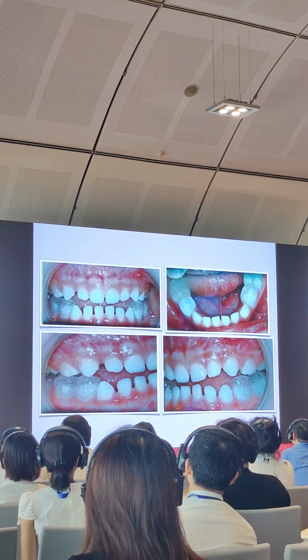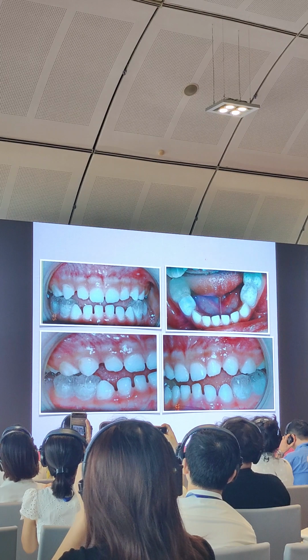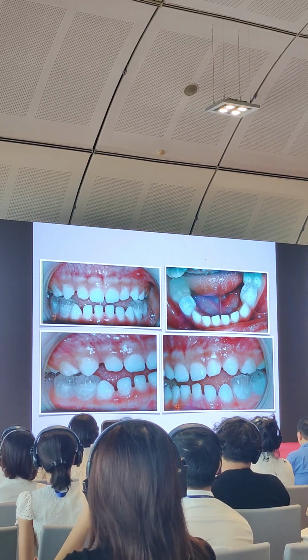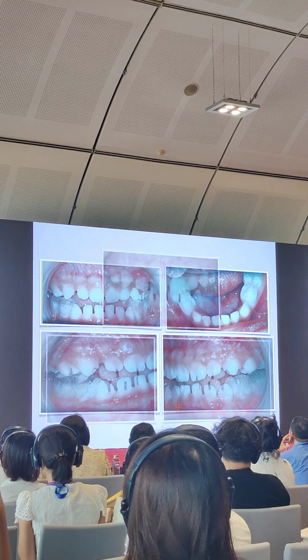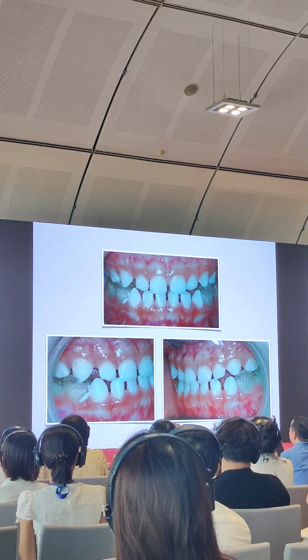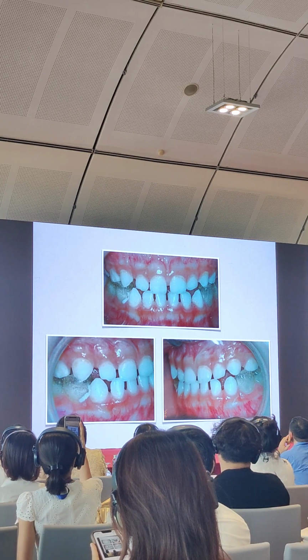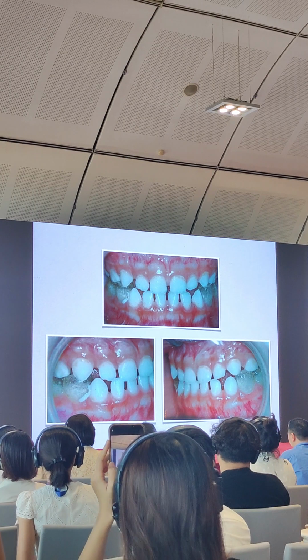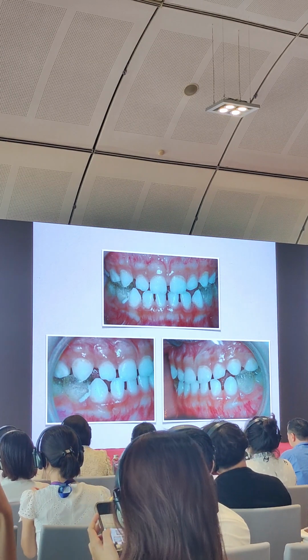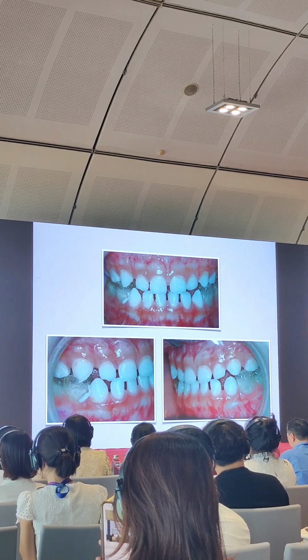So when the patient comes back, I install the overdenture, and then let the patient go home. So when the patient came back after 2 months, without doing anything, just with the overdenture, you can see now that the mandible moved a little bit backward, and you get now a positive overjet and overbite.